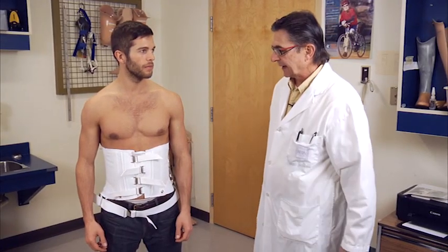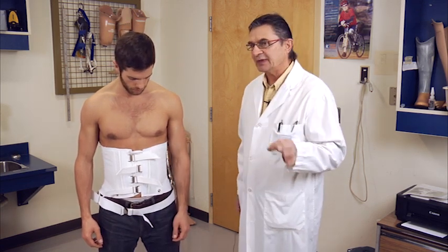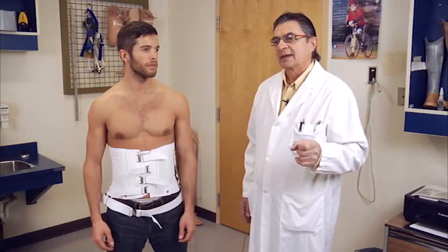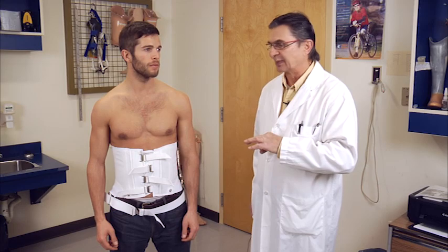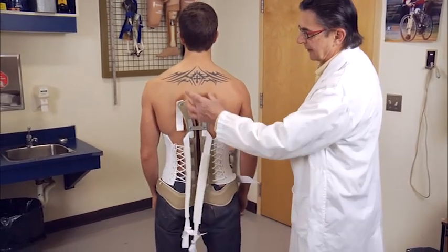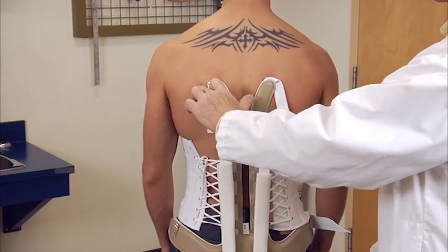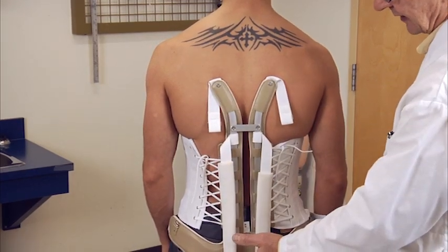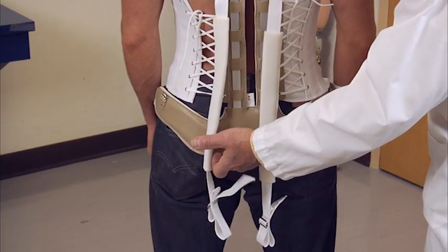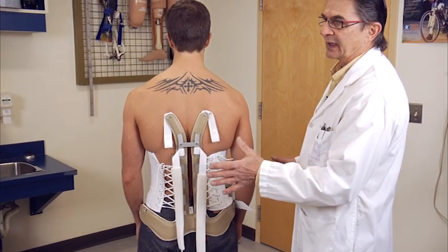We've got Eric in what's called a Taylor brace. A Taylor brace is an extension brace — it's a thoracic lumbar orthosis. There are a few differences between the Taylor and the chair back. The chair back is a lumbar extension brace, while the Taylor is a thoracic lumbar extension brace. We've got posterior stays along the paraspinals. These uprights should come about mid-scapula. The pelvic band is the same as the chair back — we want it at the top of the coccyx, about mid-butt. There are no lateral stays on the Taylor because this is simply an extension brace; we're not controlling lateral movement.